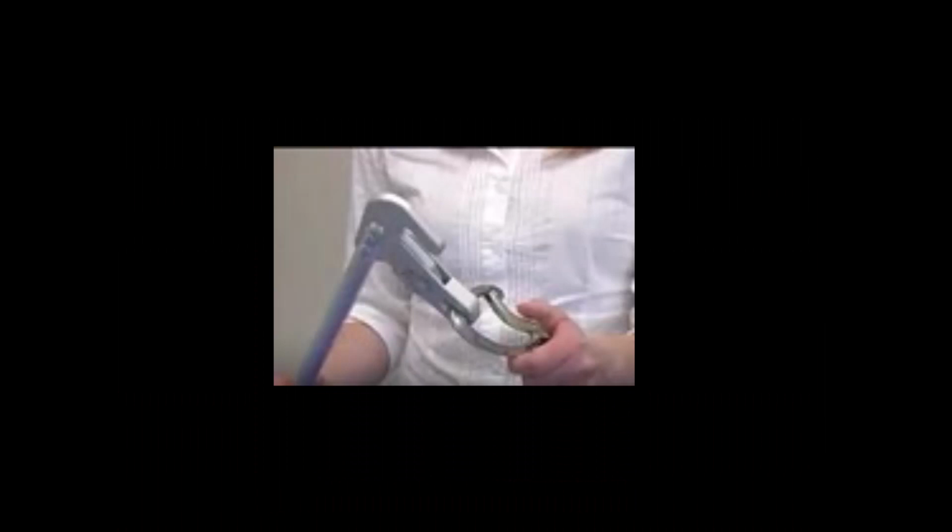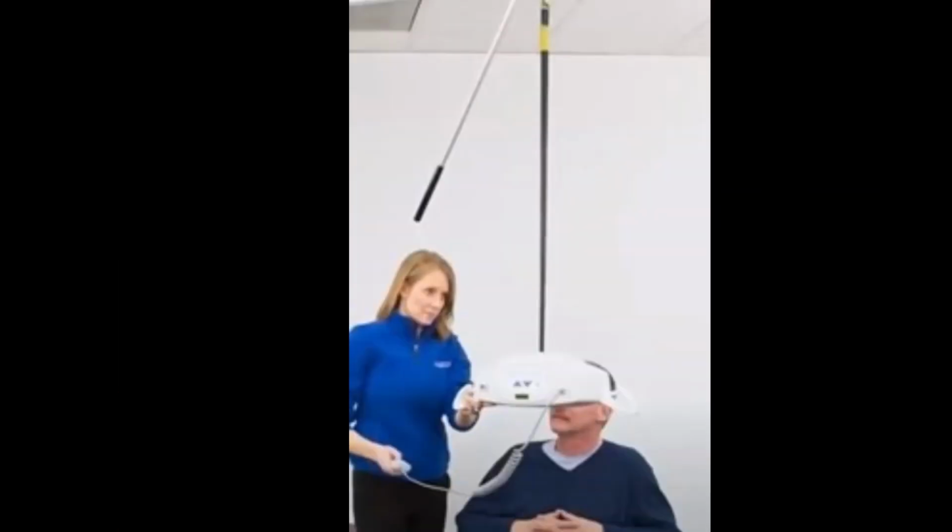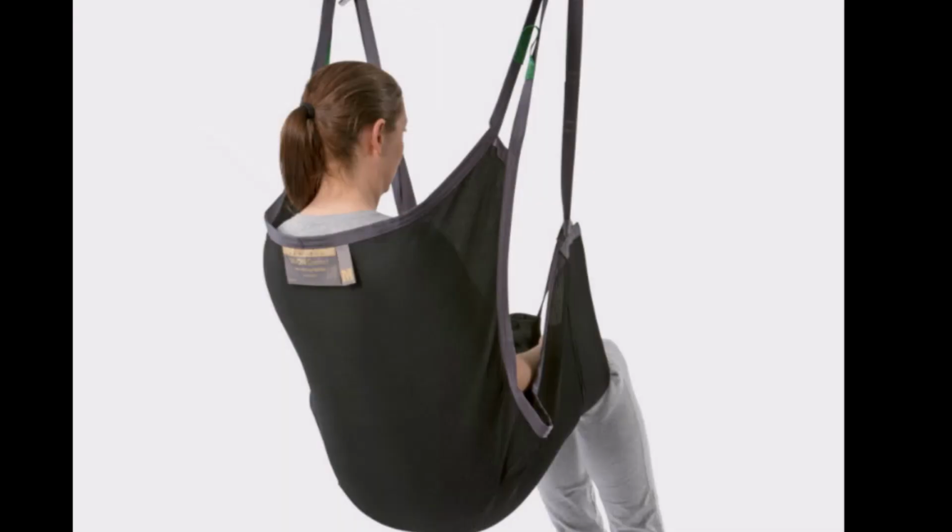If the P440 motor needs to be removed or relocated to another track, please refer to the portable lift video for detailed step-by-step instructions. Island Health also uses Goldman products, which includes tracks, motors, slings, and floor lifts.